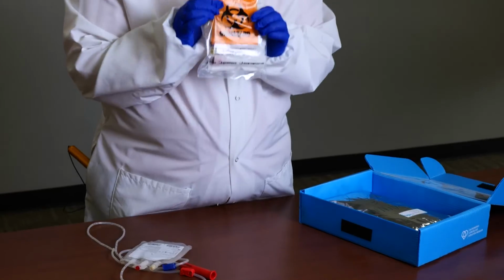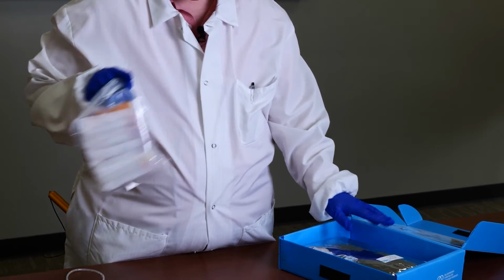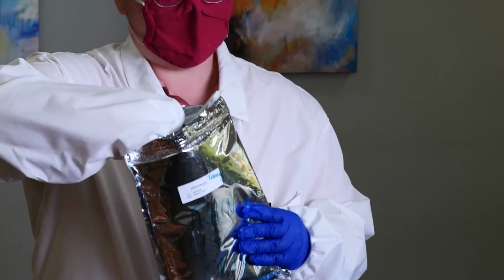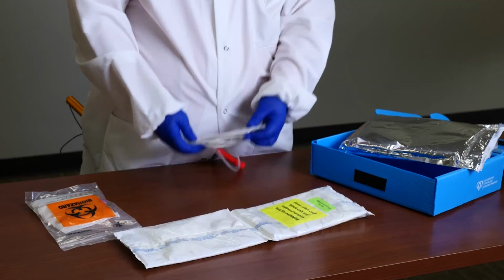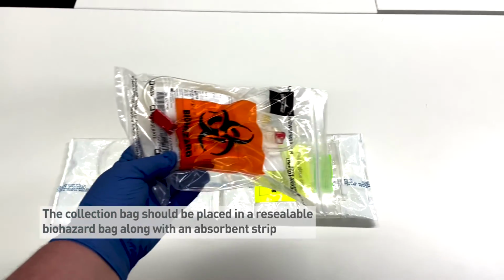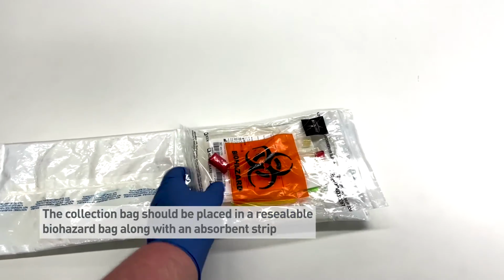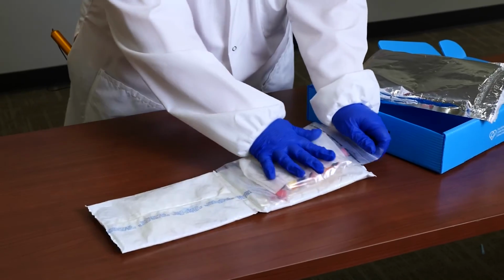Packaging for the Macopharma bag for C-section deliveries or vaginal deliveries is the same as the Fresenius Kabi bag for vaginal delivery. Our maternal samples that we collected earlier have been waiting for us in the box. The foil pouch and gel pack can be removed from the box. The Macopharma collection bag with our cord blood unit will be placed on top of the bright sticker on our gel pack, and then our packaged maternal samples will go right on top of that.